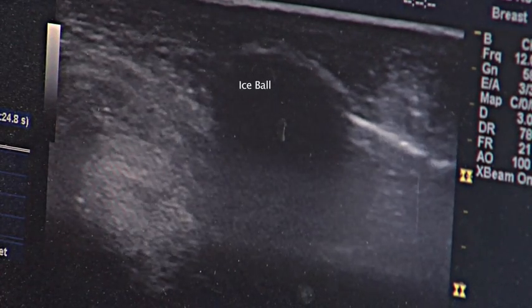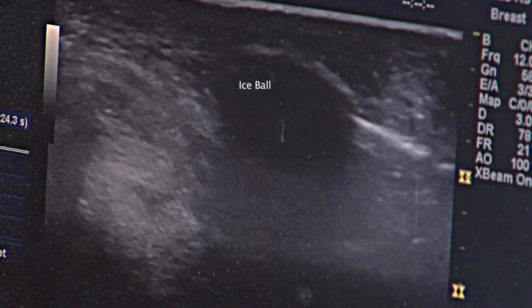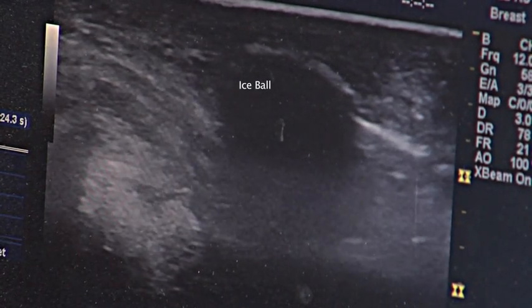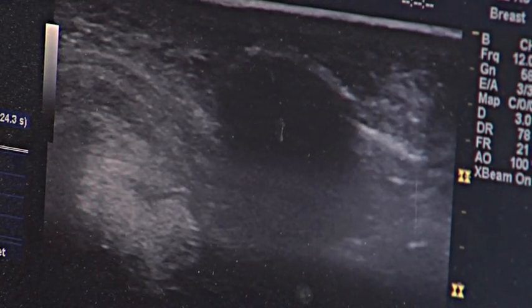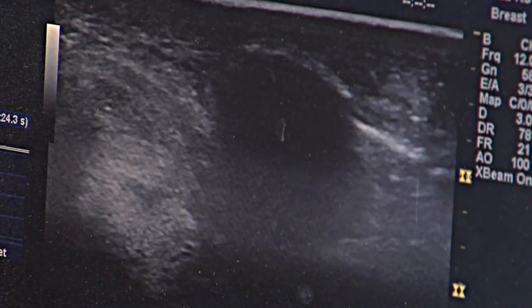Now, you're only going to get this image if you use the top piece of ultrasound gear. It's just not going to show up on cheap ultrasound. But there's an amazing picture of how large the ice ball is and the area that it's covering. As long as you know you're close to the nerves, you're in great shape.